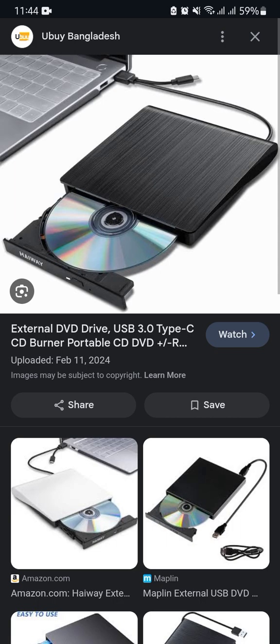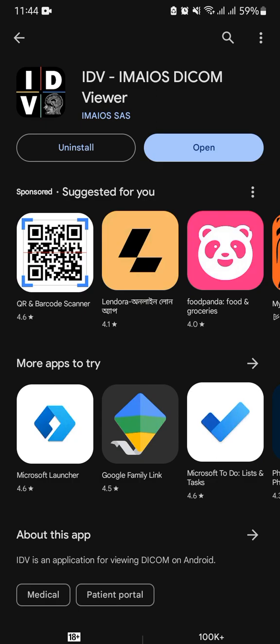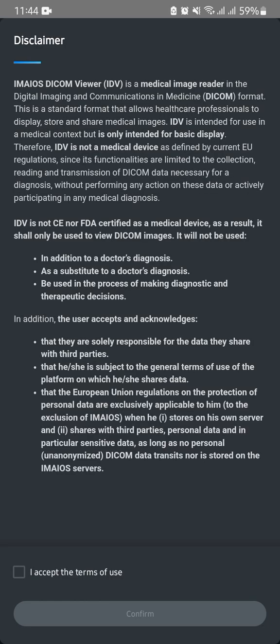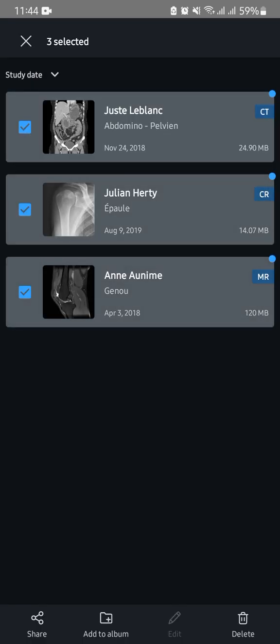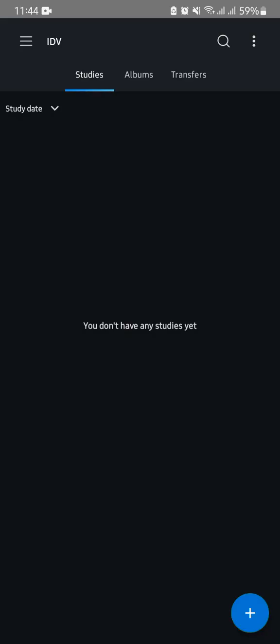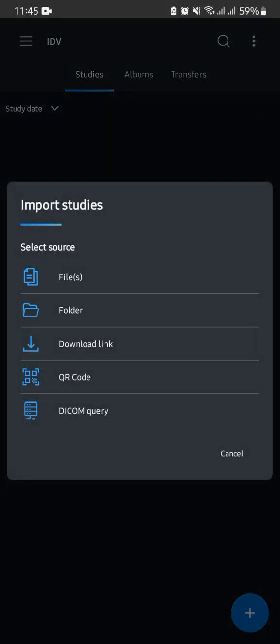I hope you have understood. Now my DICOM software is ready. There are many software options to view DICOM files, but I have chosen this DICOM file app for my comfort. There are three demo files. You must click the plus icon and give all the permissions to the software, then choose the file and select the destination.